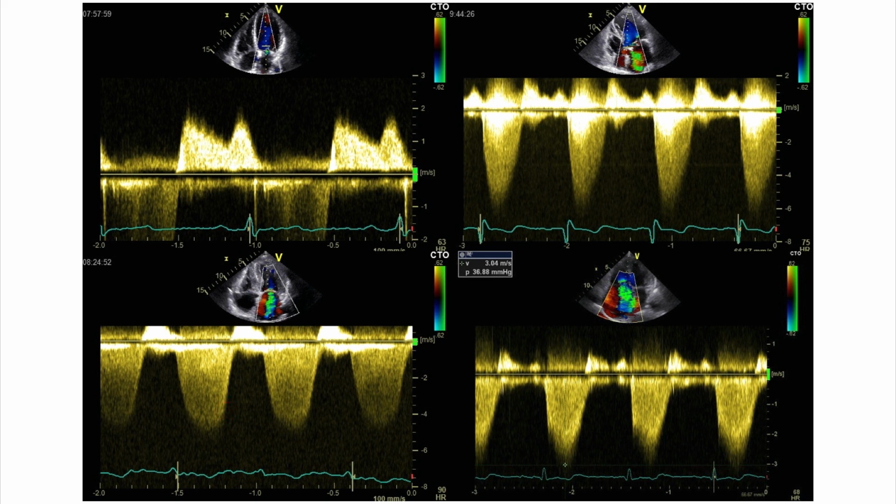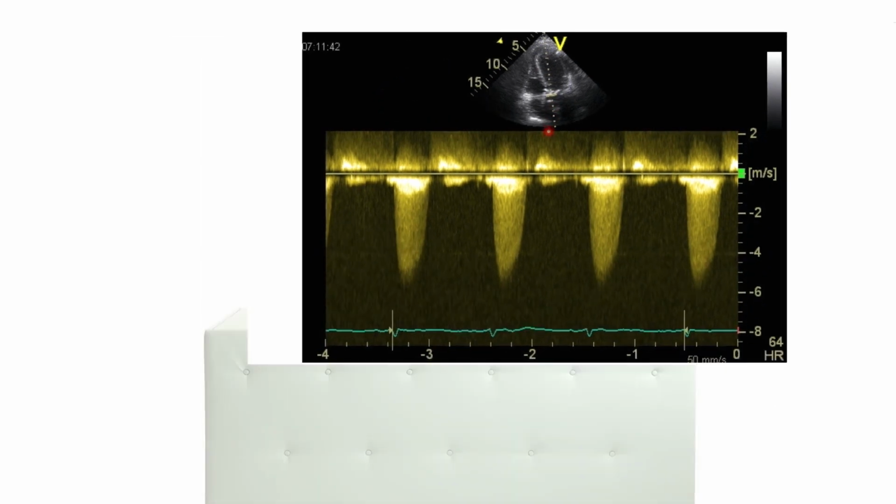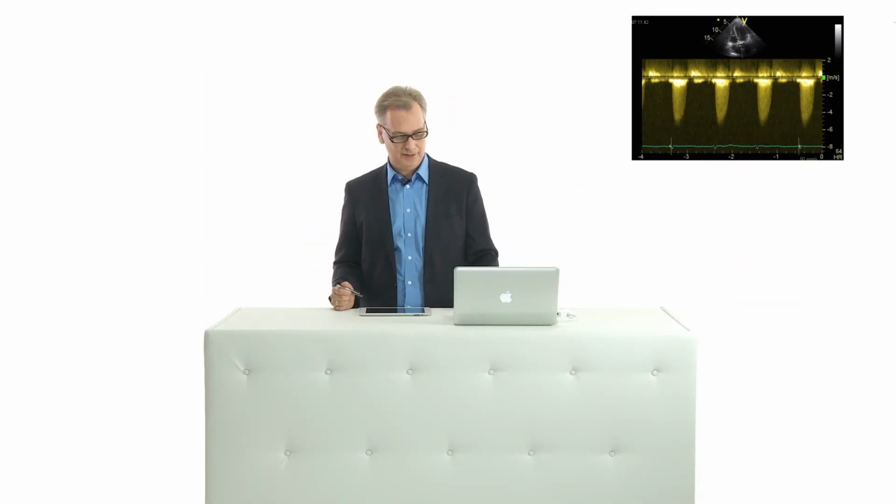So what does the signal tell us that we have in our patient? Well, we have a velocity which moves down or away from the transducer. That's why it is negative. And we have a certain velocity which is somewhere in the region of maybe almost 6 meters here. And we see that we are imaging now from a 5-chamber view, which means this has to be the velocity jet that goes in this direction, away from the valve. So this is the signal of aortic stenosis. Good.